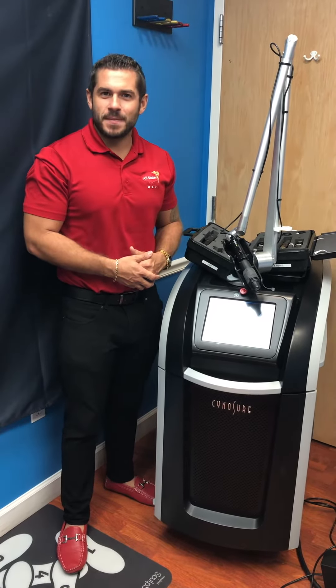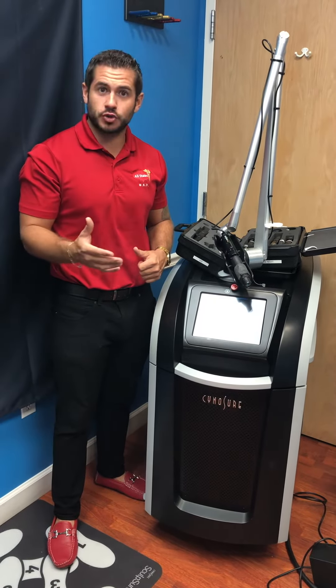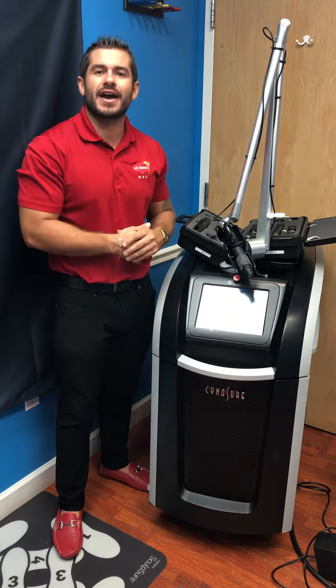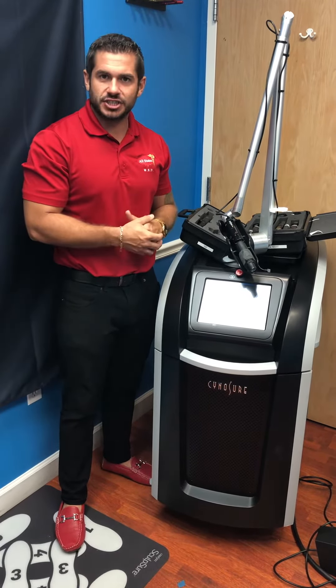It's a great day here at All States Med. My name is Joe and I'd like to talk to you about the Cynosure PicoSure laser. This right here is a great system used for a variety of different procedures, including tattoo removal, pigments, lesions, and much more.